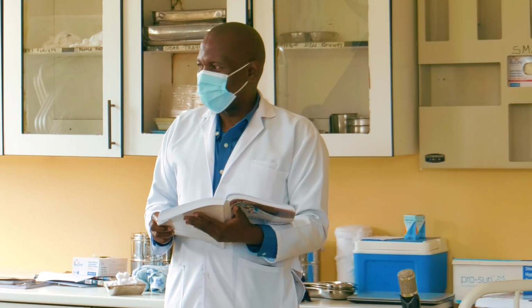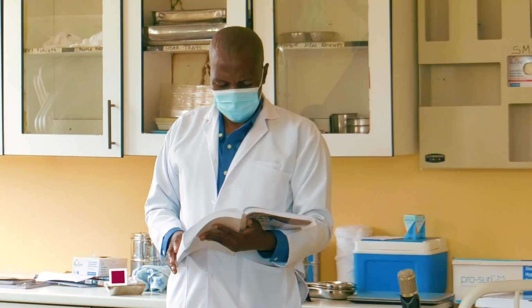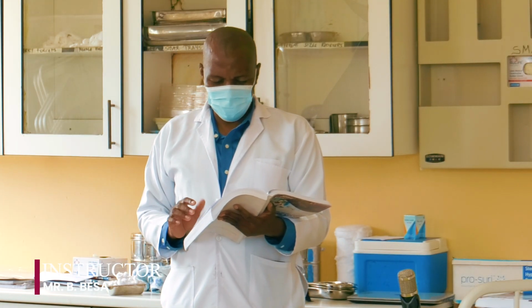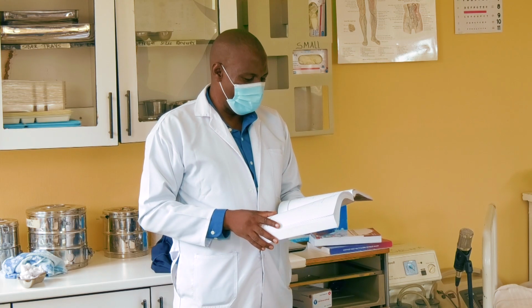Close nearby windows, just the windows near where the patient is. Don't close all the windows because we need the aeration, okay? Assessment: check the type and extent of the wound. Why are we interested in the type of the wound? The wound may be infected, the wound may be dirty, so do not close if that's the case. Ensure the wound is just clean, okay?